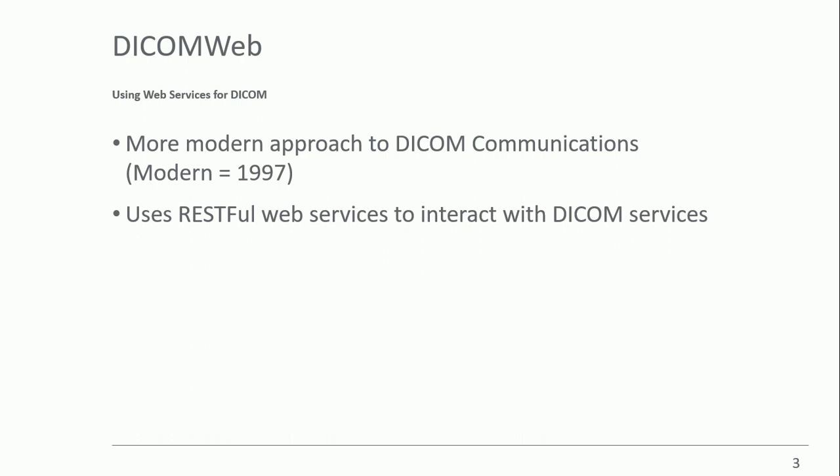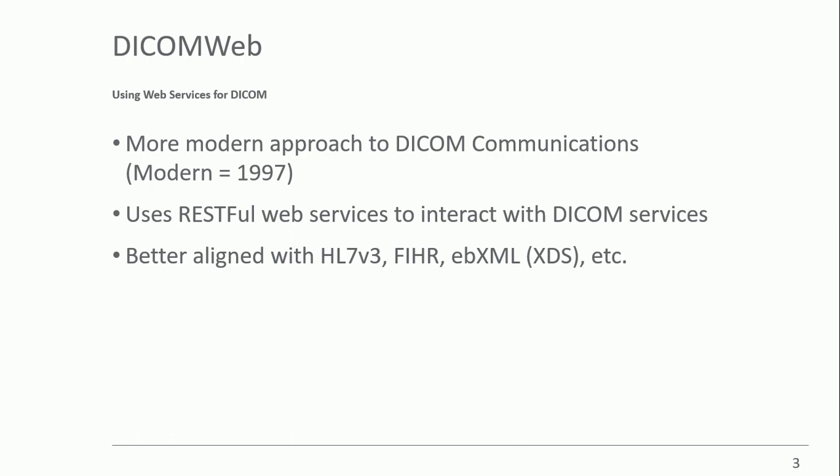But the hope is that in the future, we're going to be using these RESTful web services to interact with DICOM services, as opposed to using this older approach with TCP with these low-level communications. And why is that a good thing? It's going to be better aligned with things like HL7, because HL7v3 is web services, FHIR is web services, XDS, which uses ebXML, which is an OASIS standard, that's also web services.